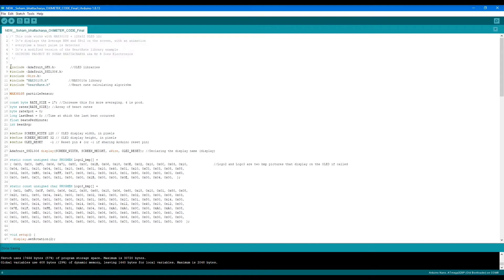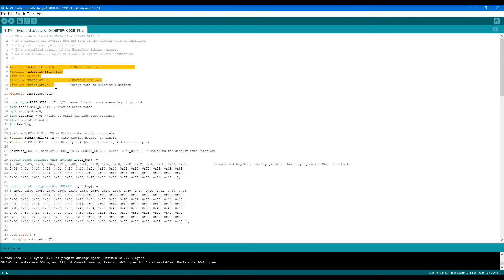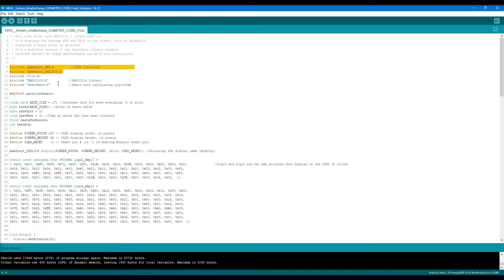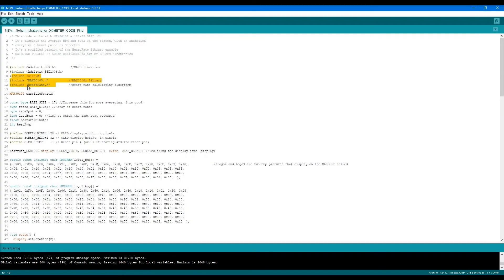These lines that are highlighted here are the libraries required to make this program work. The first two are the OLED display libraries: the Adafruit graphics library and the Adafruit SSD1306 OLED display library.